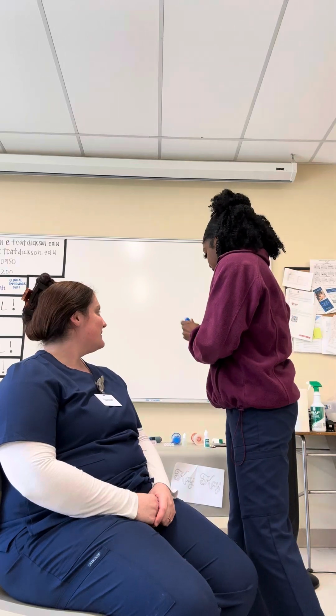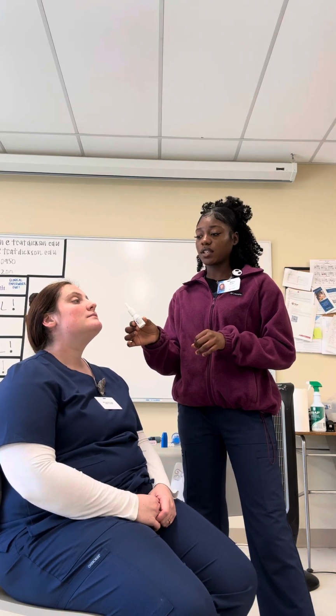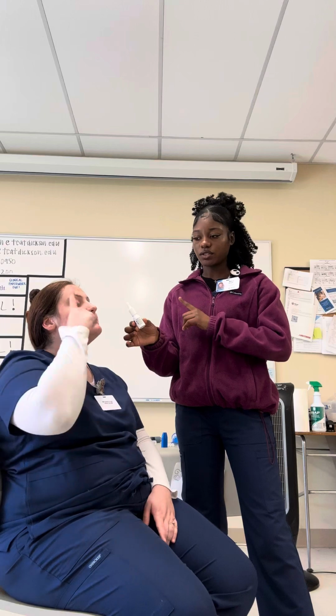For this purpose, she is sitting. So you're gonna take this off. This is what the applicator looks like. So when you're administering nasal sprays, you are going to whatever nostril, place it in, and then you're gonna have your patient occlude the opposite nostril.